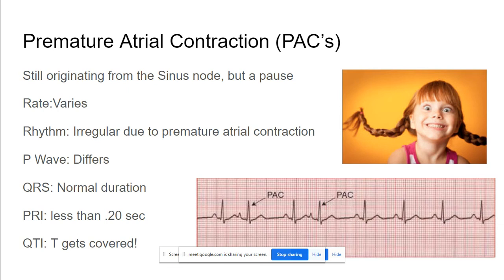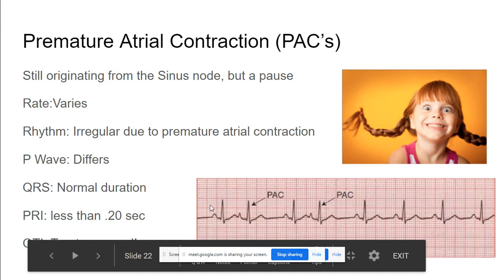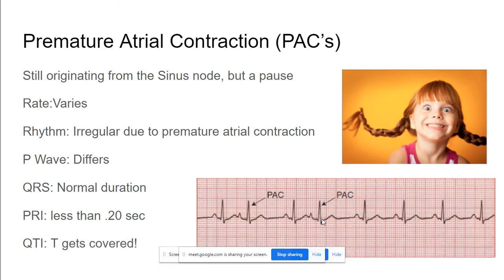All right, premature atrial contractions. Basically, the P wave gets so excited, going crazy, and just fires too soon. Okay, and here is the regular underlying complex. Everything looks regular because these complexes are the same width apart, but every once in a while you get a PAC, which you would think if it stayed normal, the complex would come about right here or right here.